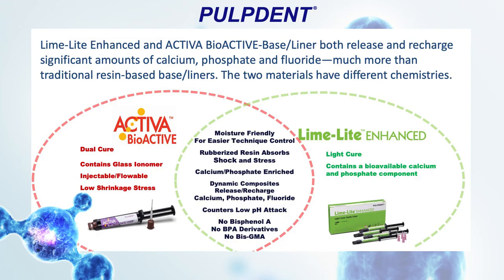Another important point is the rubberized resin in ACTIVA absorbs shock and stress, so it's not as brittle as a conventional composite. So these are important points to think about when you're choosing your materials.